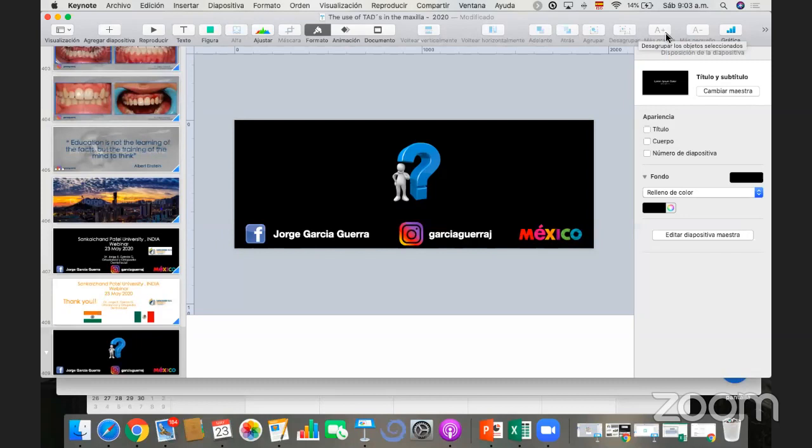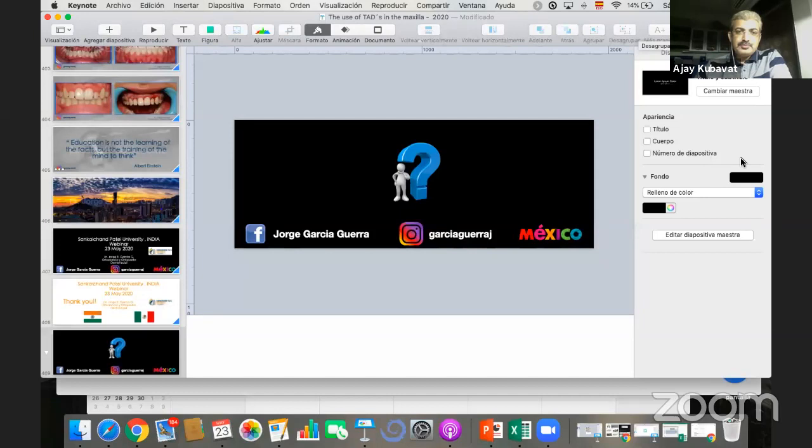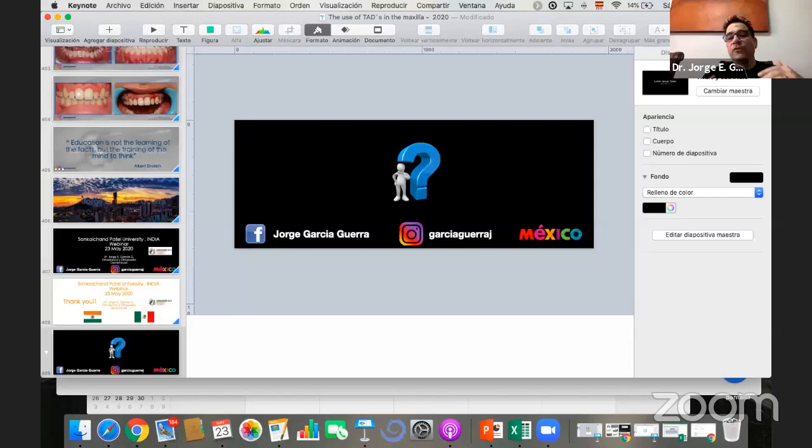Okay. There's a question from Dr. Pooja Khanna. Why do you prefer to bring the canines first in the mouth and then bond the rest of the teeth? Because if you bond the brackets at the beginning, for example, with the canine and the lateral incisor, once you put the bracket on the incisor, it's going to touch the canine, and then your vector is going to be to this side. Now, if you don't put the brackets on, you leave the incisors in free body, and as you move the canine, it's going to push the other teeth. You can see there how it pushes the teeth, and it's easier to erupt.